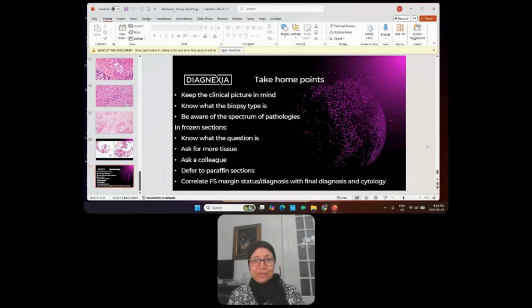Right, I've got a question here from one of our colleagues asking about single cells in pancreatic cores and how to judge them, asking whether you think these always mean adenocarcinoma more than pancreatitis.